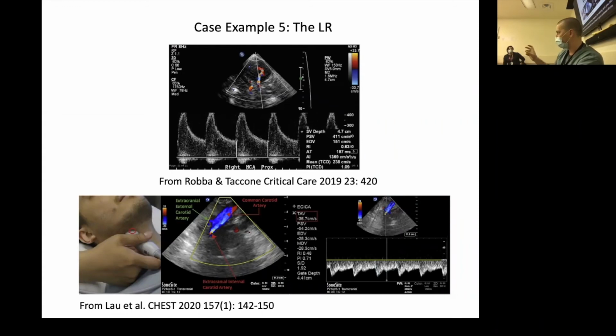You have relatively normal velocity in your internal carotid artery and very high velocity in the MCA, you know it's not a MAP or a hyperemia problem that's driving all this. And again, it's a vasospasm problem.